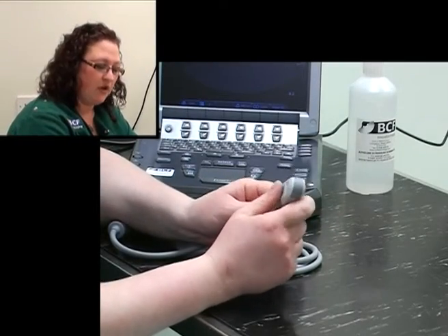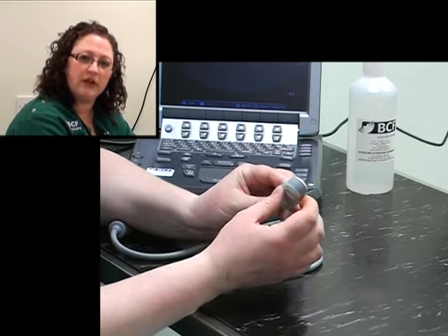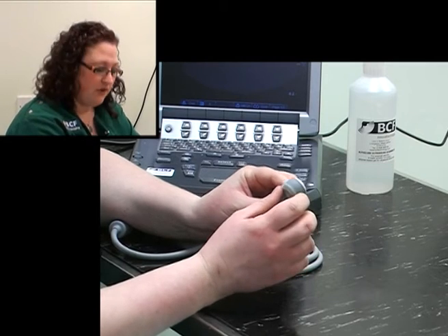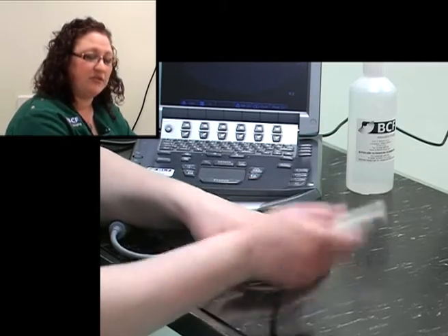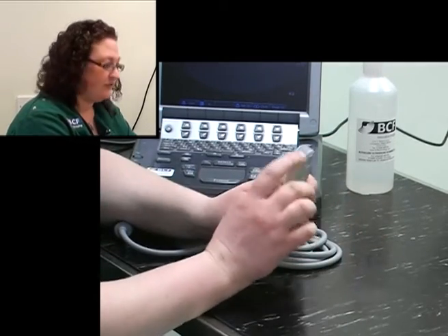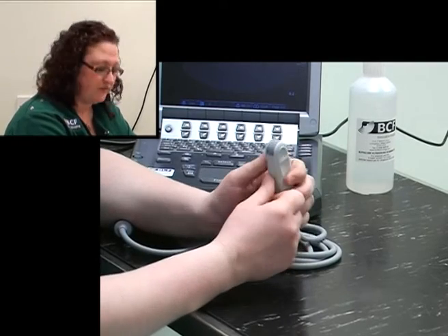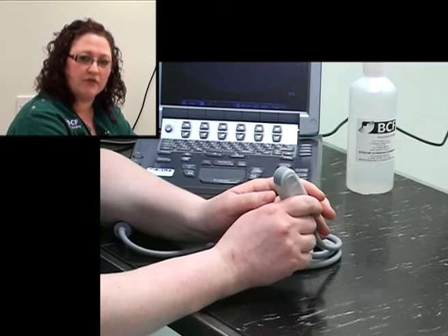One important feature to note about these probes is that they're very delicate. The crystals that actually emit the ultrasound waves are quite sensitive, and it's important that you don't damage them in any way. That means don't bash them off the table. Also, the surface is covered with a type of rubber substance, so you don't want to use surgical spirit because it will degrade it over time.